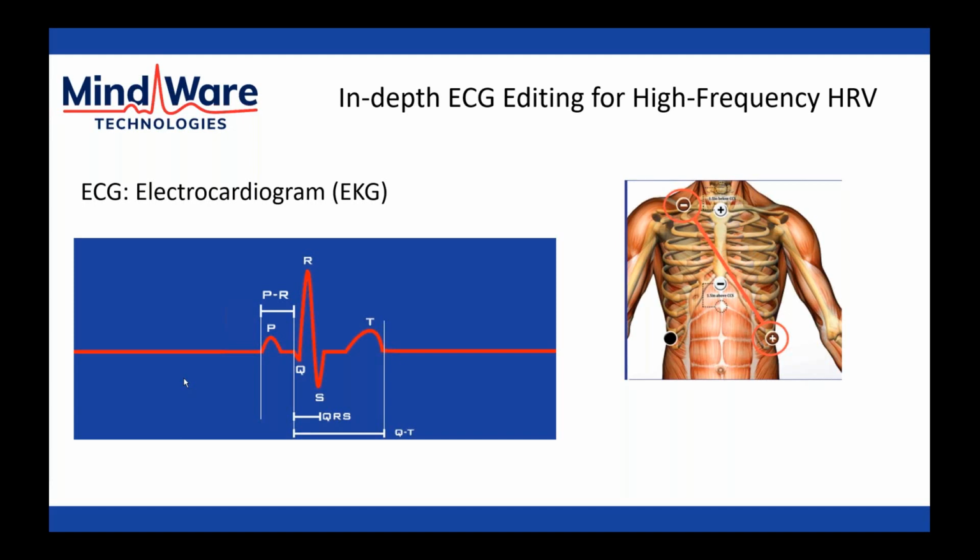It's measuring ventricular depolarization in technical terms, but for our purposes, what we really want to see is that R peak, that clear and precisely identifiable fiducial point on this cycle by which we can essentially determine beat-to-beat timing. So the R peak is always going to be positive. It can be negative if you swap the leads by accident, but we can very easily swap those back so that it's positive again, just with a single button press in the application. So no worries if it is negative, but by convention, the R peak is typically positive.